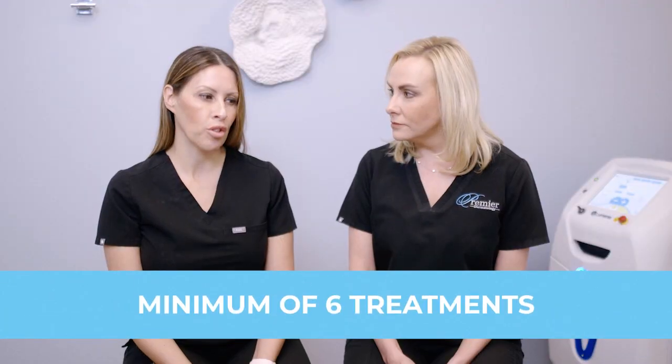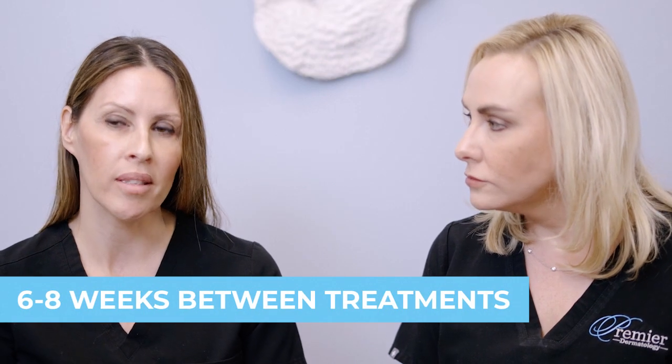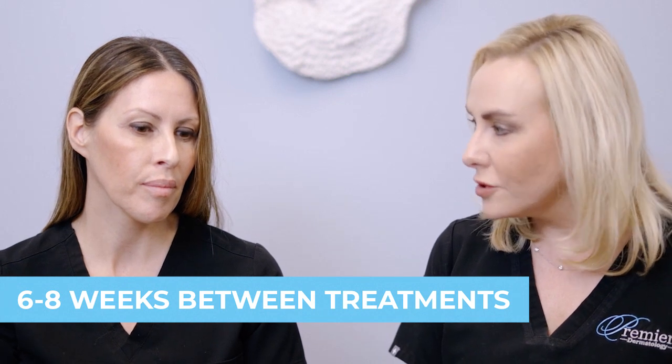So Elena, normally for someone like Kristen, how many treatments would you recommend? Minimum of 6 treatments. Very good. And how often would she come in for those treatments? Anywhere between 6 to 8 weeks. Very good. And what's the main reason for that? Is it something to do with the growth cycle of the hair follicle? Yes, we're wanting to catch the very next hair growth cycle. Right, because it works best when the hairs are in the growth phase, the anagen phase, correct?